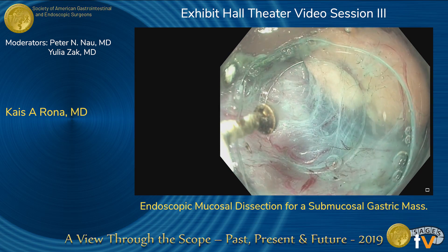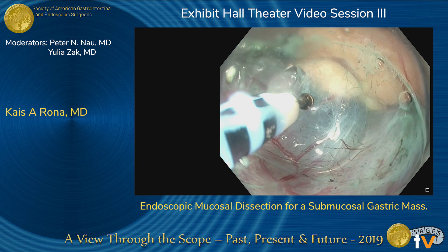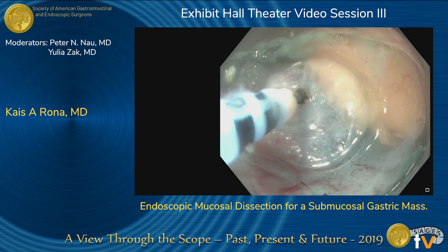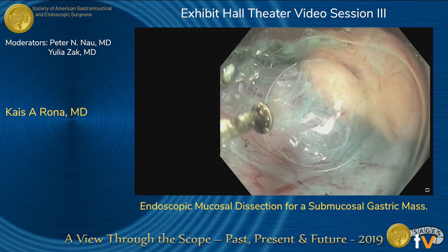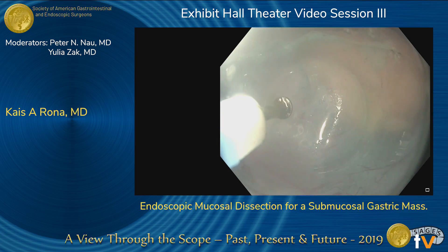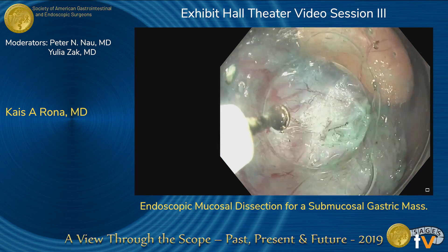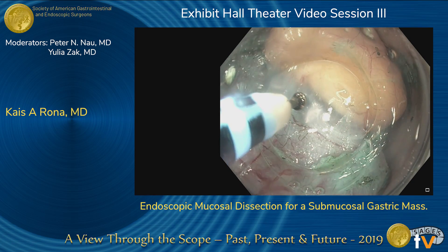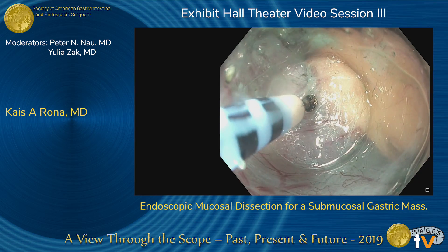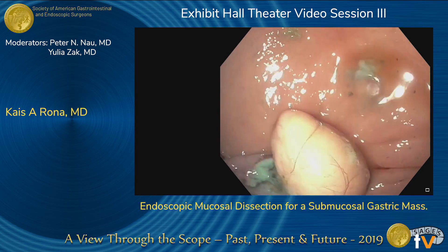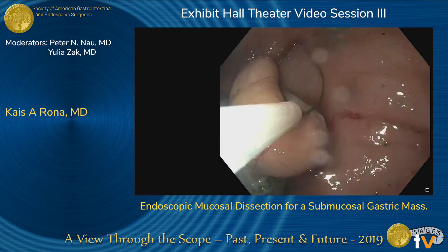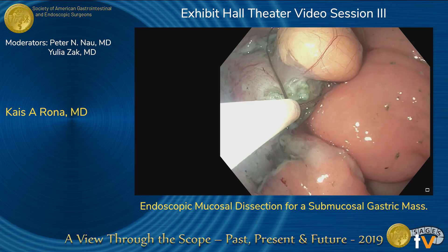It's not shown in the video, but we are injecting methylene blue and performing our lift in between. You can see we've almost got the entire mass detached from the deep tissue. Once the mass is almost completely detached, it makes the technique a little more difficult, so we use a hot snare to get to the base of the lesion and completely detach it.